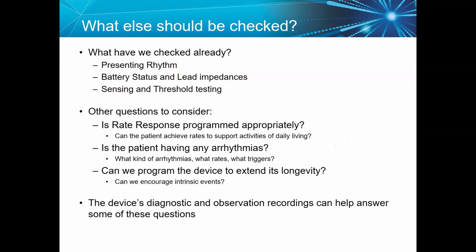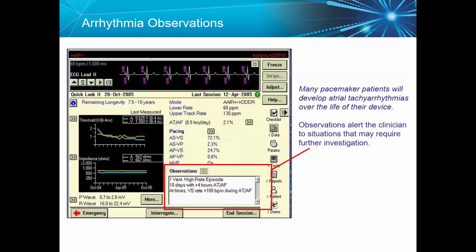Is the patient having any arrhythmia? What kind of arrhythmia? Can we program the device to extend its longevity? Can we encourage intrinsic events or no? The device diagnostics and observation recording can help answer some of these questions.